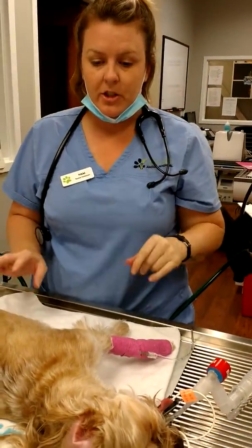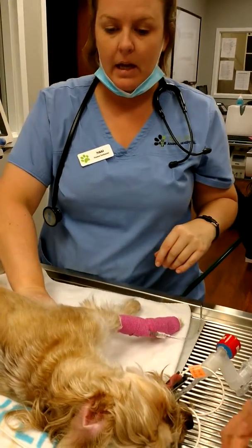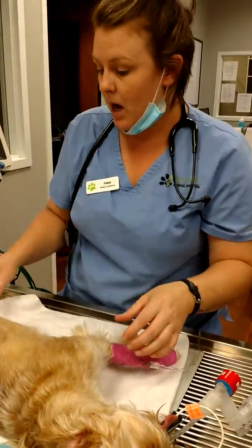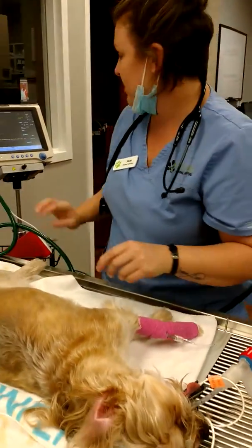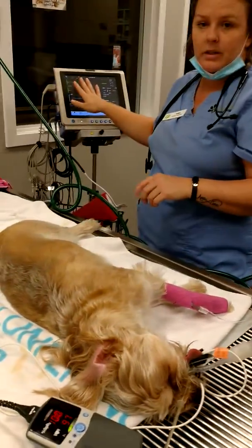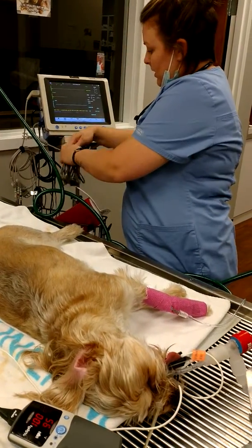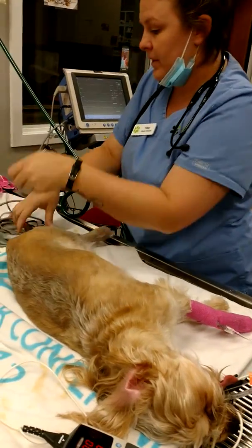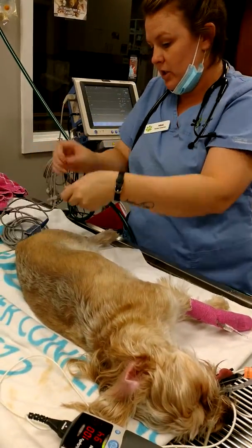So now I'm going to hook my patient up. We've got her intubated, and we've got her hooked up to the pulse ox temporarily. To show you the monitoring parameters, I've got her into our Cardell. The first thing I always want to do is hook them up to a pulse ox.